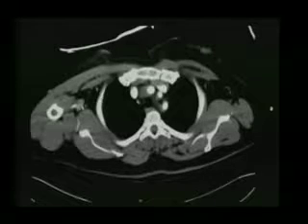This was the initial chest X-ray that was done with the concern of widened mediastinum. On the AP view, if the width is greater than 8 centimeters, they call it widened mediastinum. With the mechanism of injury, high-speed motor vehicle collision, rapid deceleration, ejection, as well as concern for mediastinal widening, a CT scan was obtained in the ER.